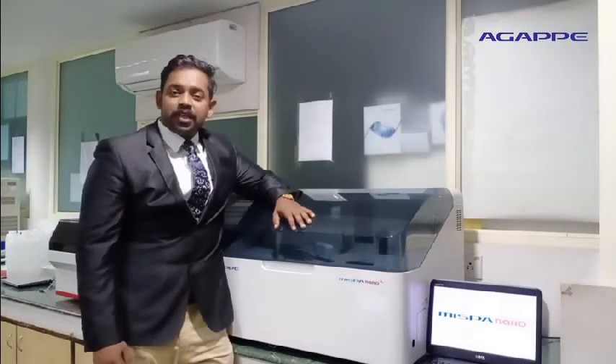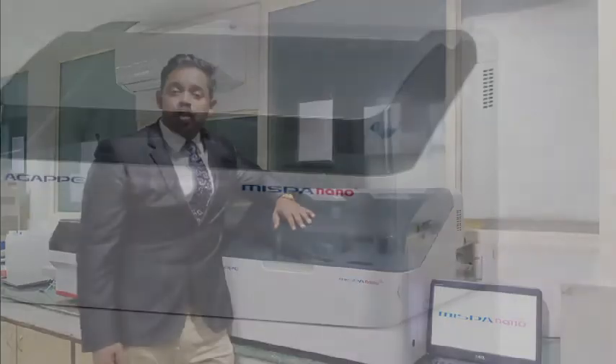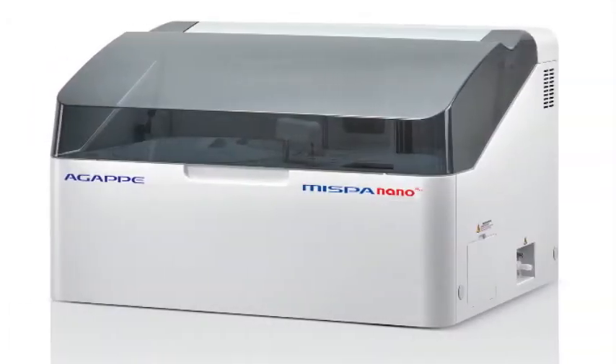Today, I would like to present how Agape is engineering a new momentum in IVD automation with its fully automated biochemistry analyzer, MISPA NanoPlus. This particular analyzer can help upgrade your laboratory to perform more tests per sample, more samples per run, and more tests per reagent pack.